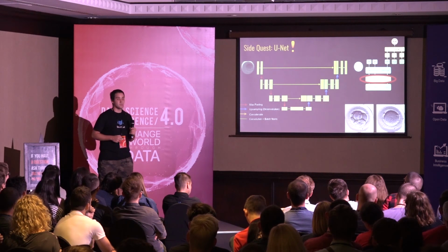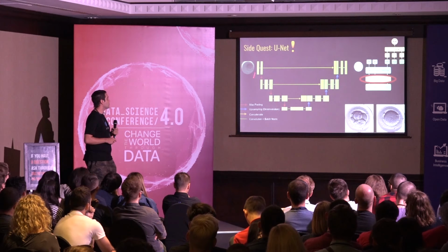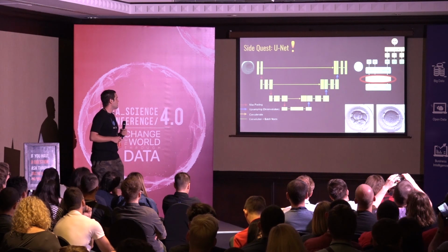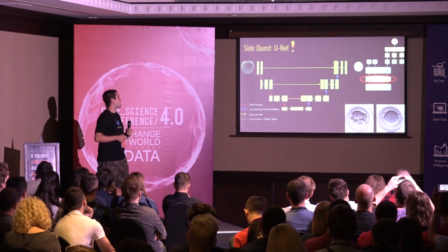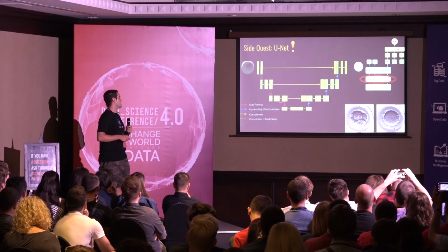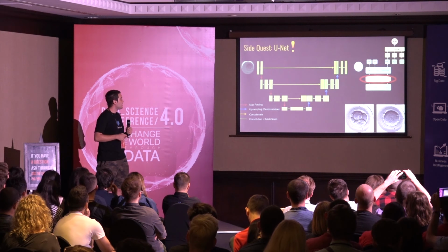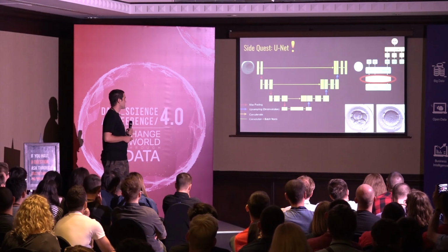Basically, it is an autoencoder. So we have an encoder part, which has several convolutional layers, followed by max pooling to reduce dimension, and then again several convolutional layers, followed by max pooling, etc. And this is the feature extractor.